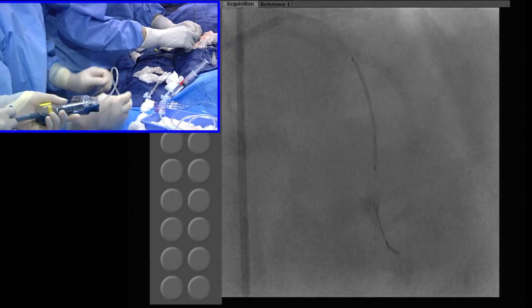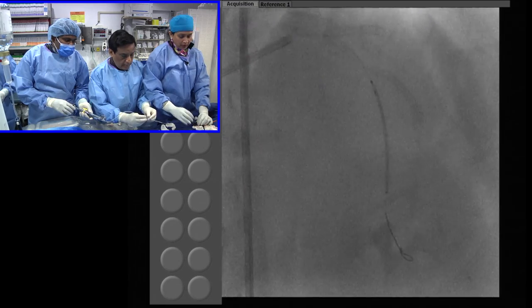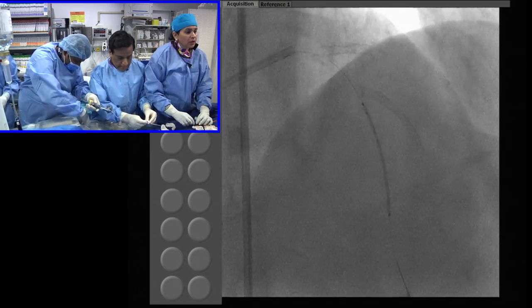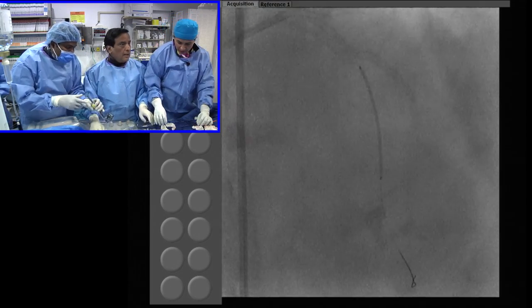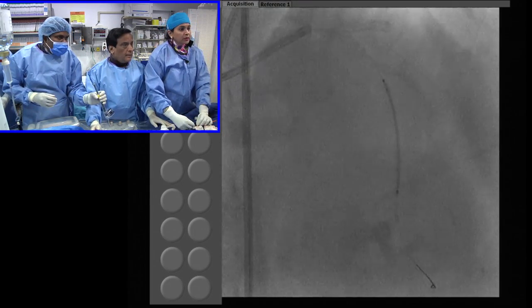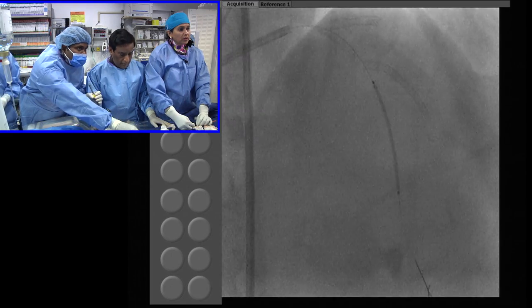Another test. Too long. I'm telling you, way too long. Twenty-eight, we could have been okay. We'll have no space for the Lima. Good. Ready? Okay. Don't need too much overlap.